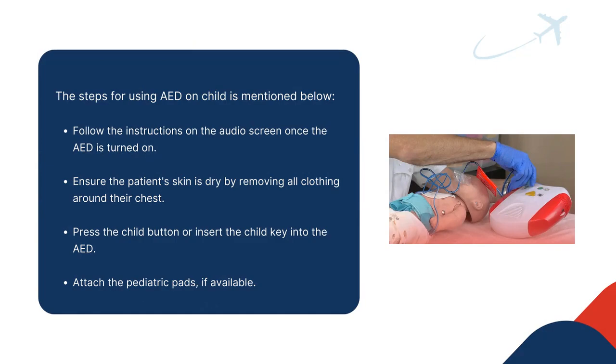Follow the instructions on the audio screen once the AED is turned on. Ensure the patient's skin is dry by removing all clothing around their chest. Press the child button or insert the child key into the AED. Attach the pediatric pads if available.